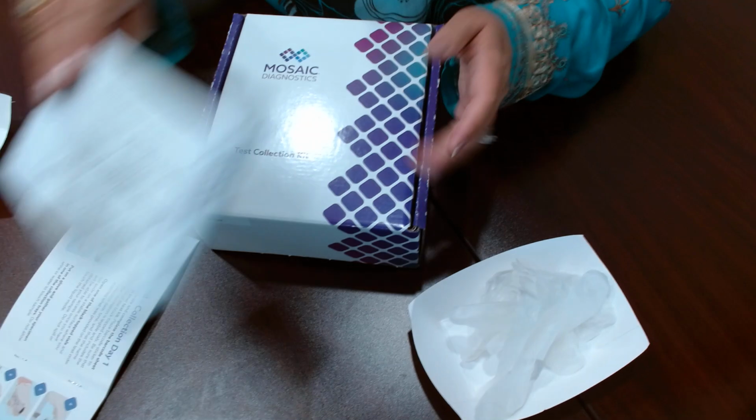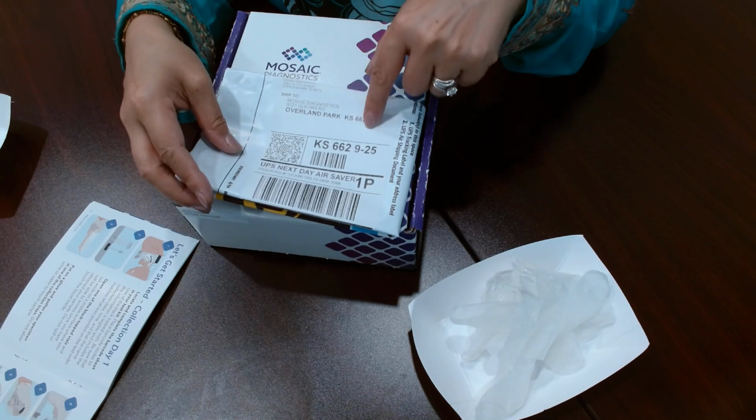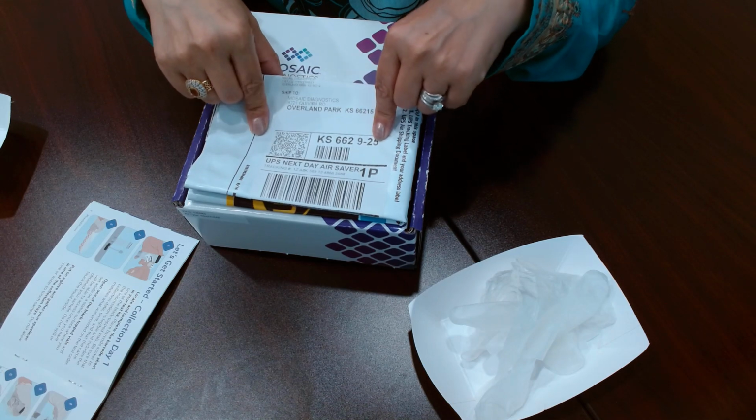Then you're going to put it inside this mailer. And like I said before, please ship it Monday, Tuesday, or Wednesday. Do not try to ship it later than that, so that it is the next day and it arrives at the lab in time.